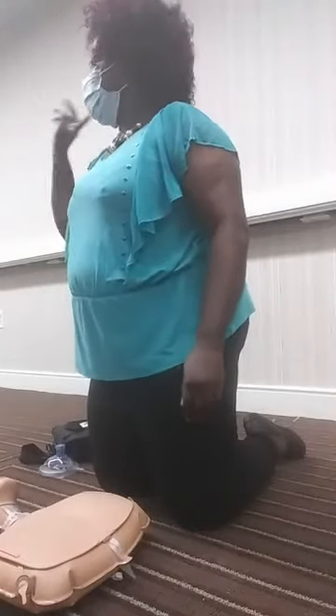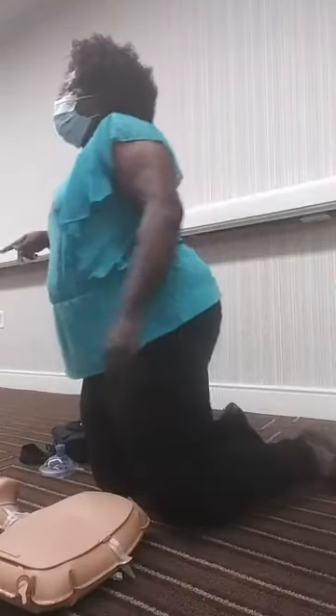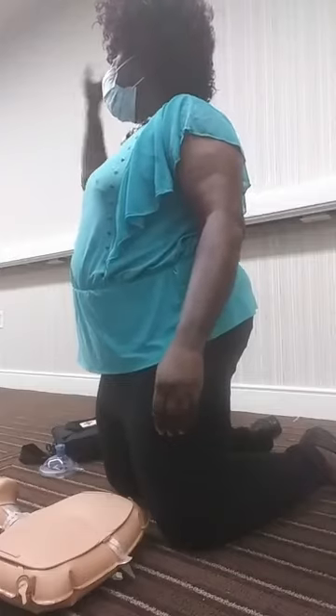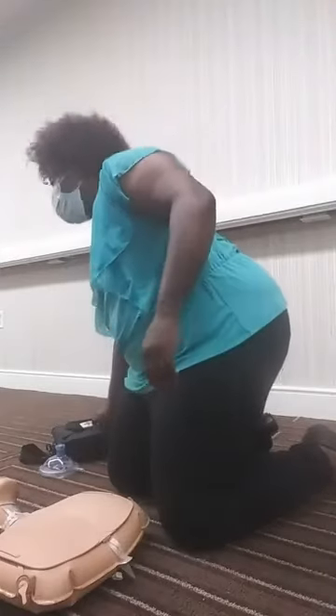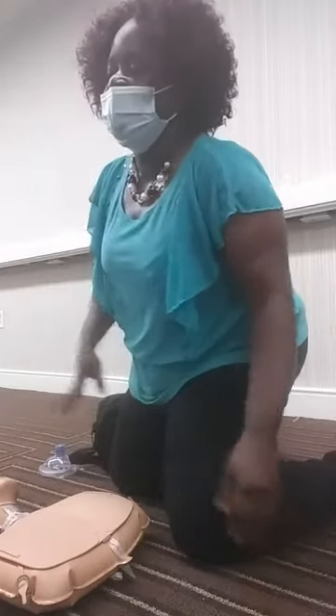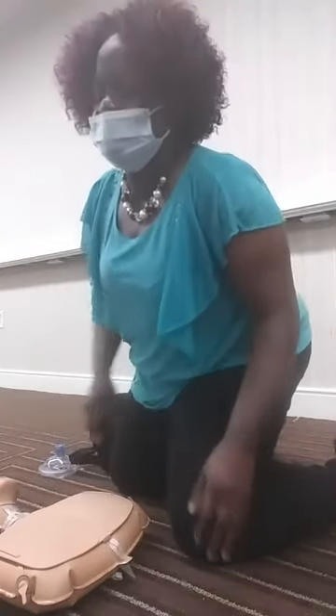Let's each of you get with a partner. One person gets started with the compressions and breaths, starting with scene safety, and the other person can bring the AED.